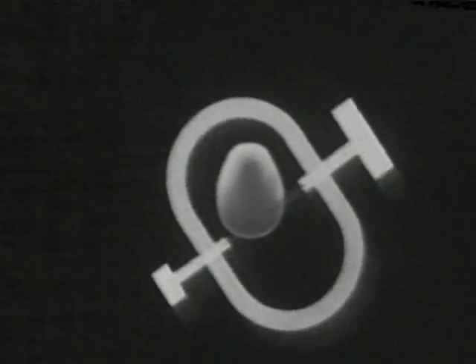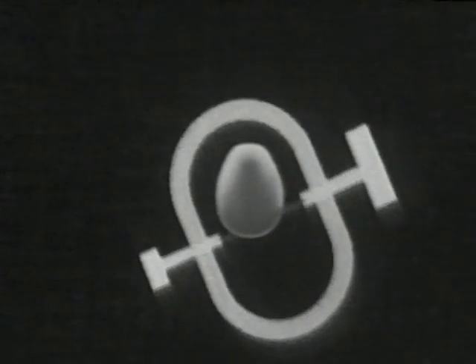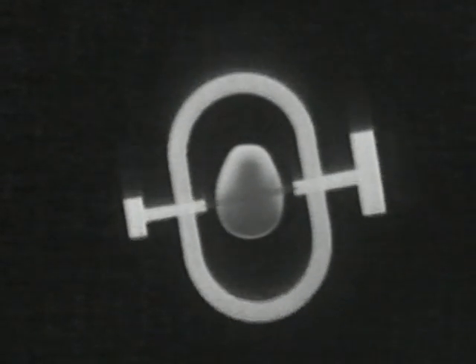By mounting the X-ray tube and crystal detectors in a common frame, the collimated X-ray beam can be made to scan along the plane of the slice. During this movement, the irradiation of the slice is regarded as a continuous sequence of beam paths or X-ray transmission profiles.